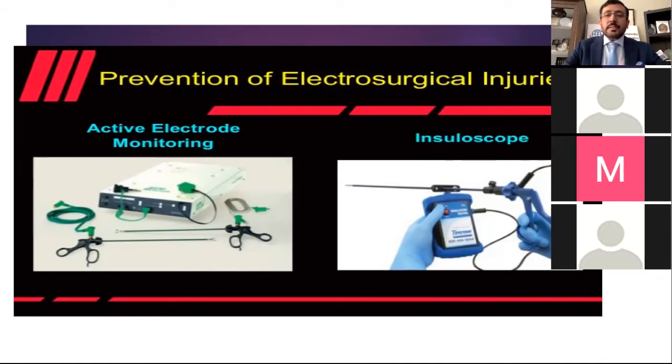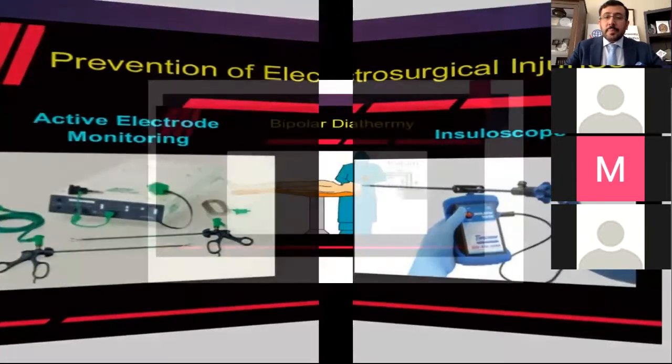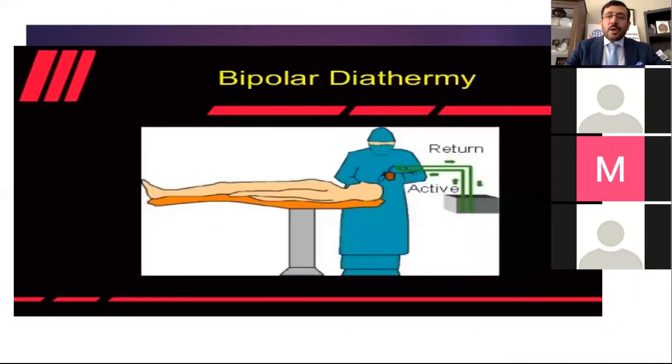Yes, there is a chance of damage, and that is not good. Then if the patient goes home, you did just a lap coli, excellent job, and the patient comes back with generalized peritonitis. So that is a disaster. Now we will talk about bipolar diathermy.